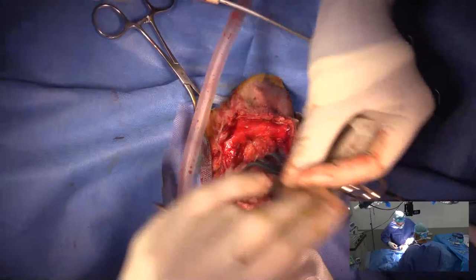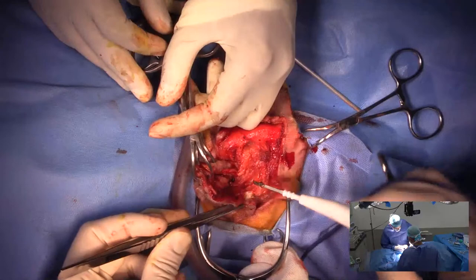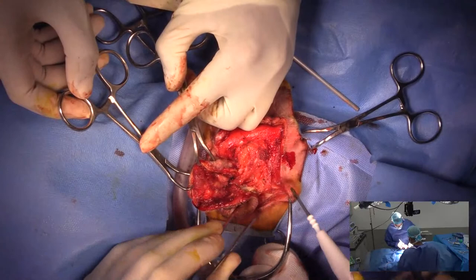Now it's getting more and more important that I stay right on the auricular cartilage here. And that's, again, in order to avoid the facial nerve.